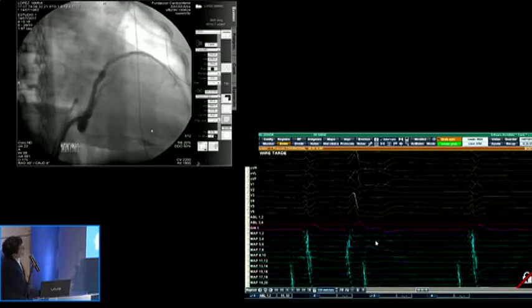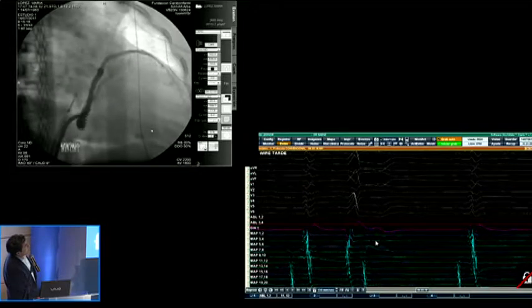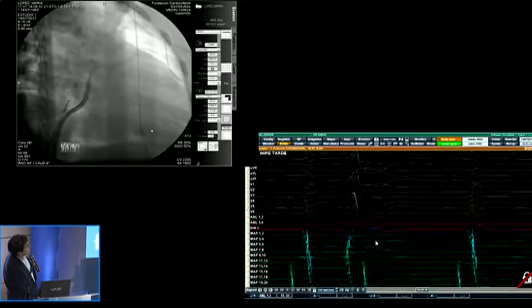No, I just wanted to show them. No, but it's too small. Yeah, it's very small. The one that goes septal, no, base, the one that goes to the, well, here we see a basal, but we don't know whether it's septal because we don't have the left oblique. No, that is too proximal.